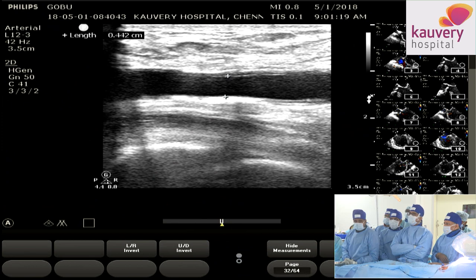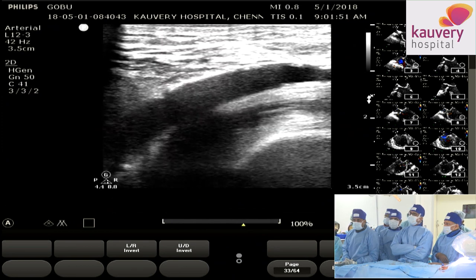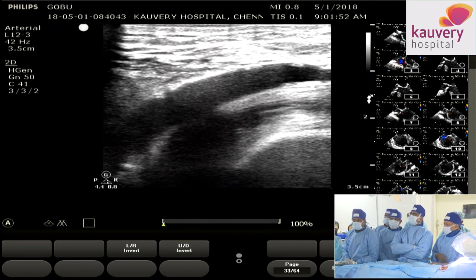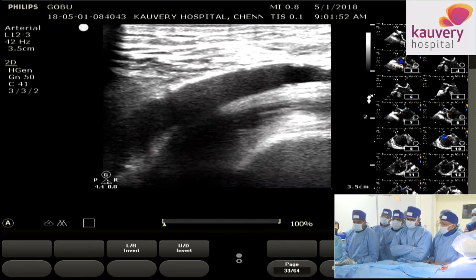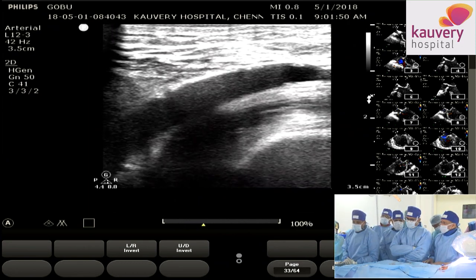This is the mid-common femoral level. Next. Suppose you have vein grafts, and this is just as the vessel arches into the iliacs. Would you protect the coronary? Yeah, Saibal, what are you saying? The question was, if you have vein grafts, not arterial grafts, would you end up protecting the coronaries if the coronaries are low? If you have patent vein grafts?